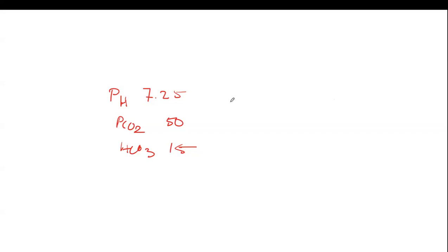So if we see in this patient, pH is low, bicarbonate 15, so that's low, PCO2 50, that's high.